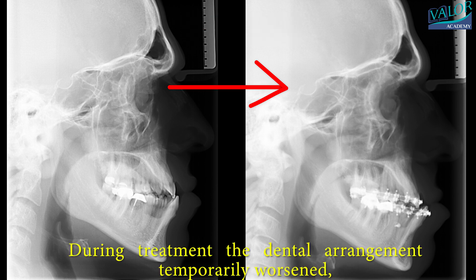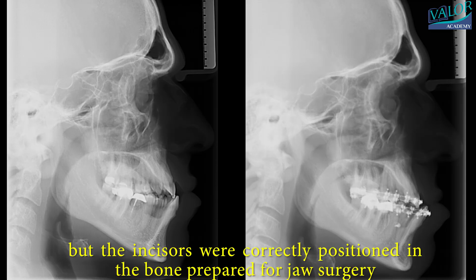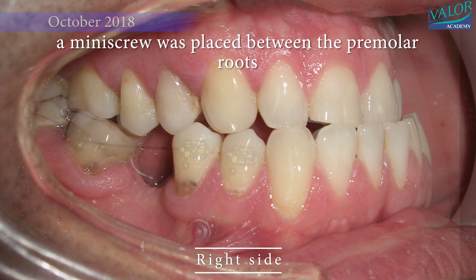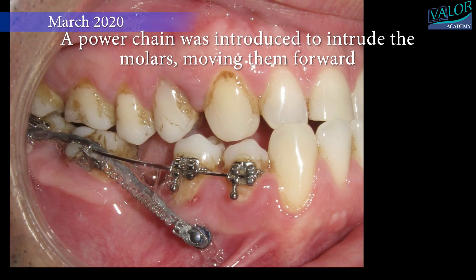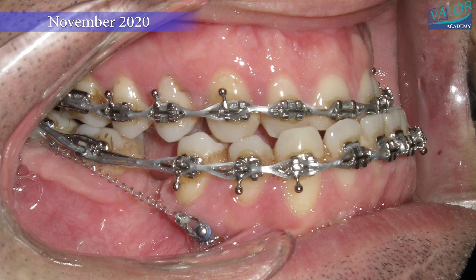During treatment, the dental arrangement temporarily worsened, but the incisors were correctly positioned in the bone prepared for jaw surgery. Braces were applied to the lower right quadrant, and a miniscrew was placed between the premolar roots. A niti power spring was used for molar protraction, and later, a power chain was introduced to intrude the molars, moving them forward. Braces were also applied to the upper left teeth to close the space from the missing molar and adjust the wisdom tooth.